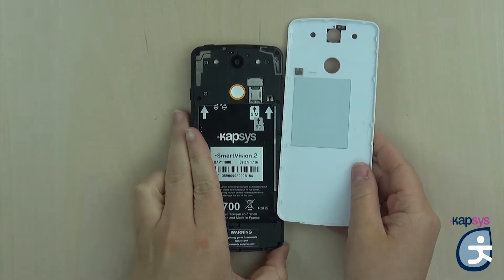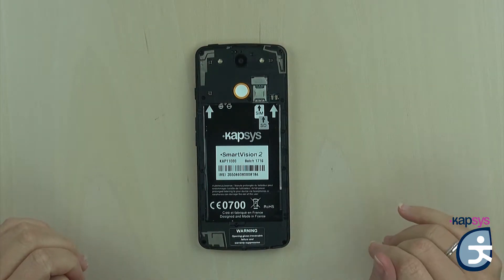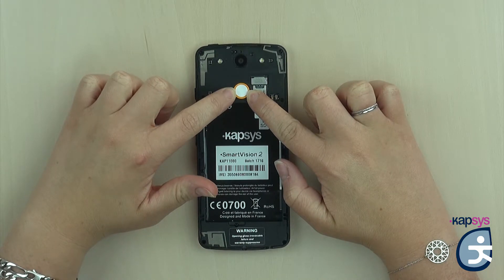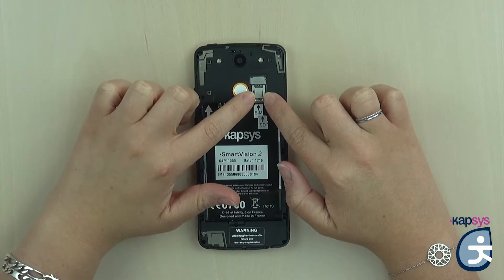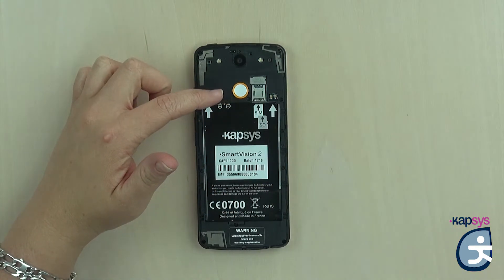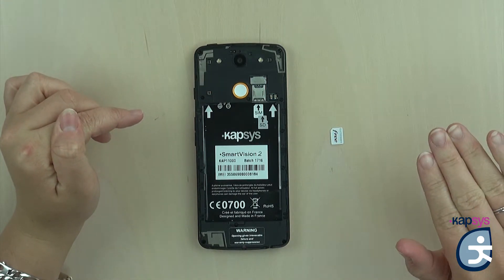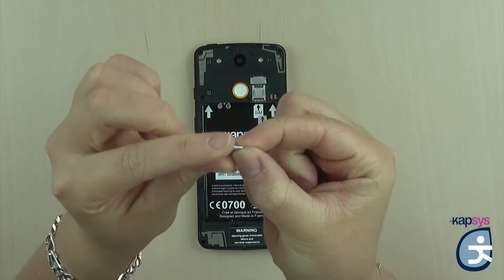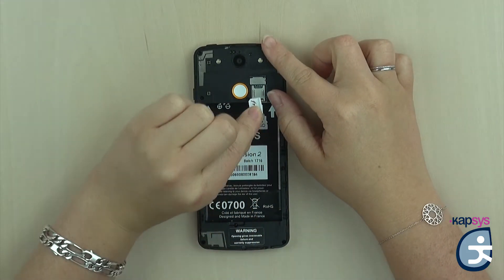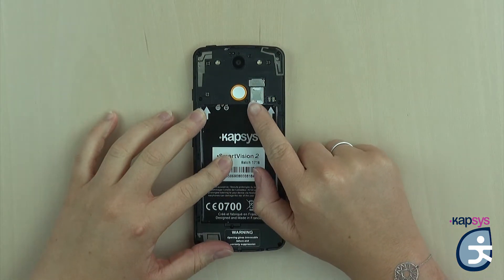The back cover is now removed and you can now insert the SIM and then the SD card. Just above the battery, in the middle, you will find a push button — this is the SOS button. On the right of this button are the SIM and SD connectors, one above the other. First there is the SIM connector and above it the SD connector. The SIM card is nano format, the smallest of the SIM card formats. The SIM card is beveled on a corner, so you must put the beveled corner at the top left. Just slide the SIM card into the small drawer all the way to the end without forcing.